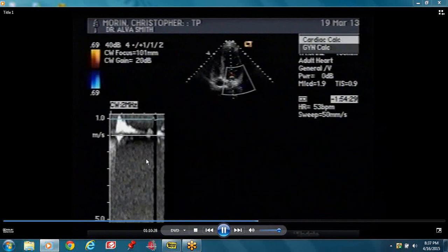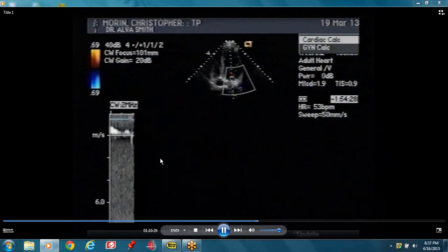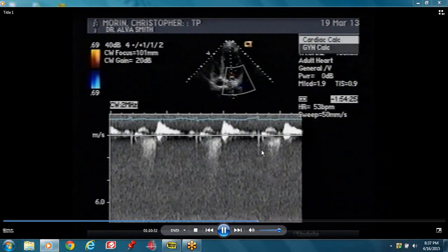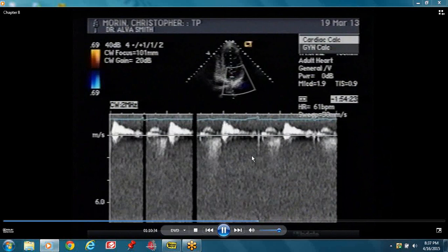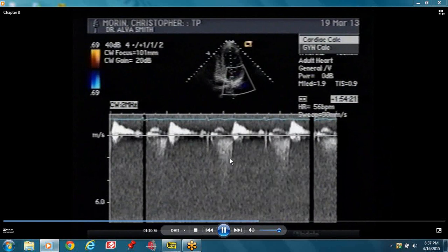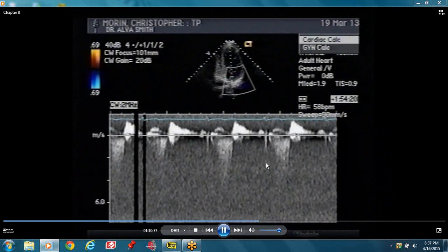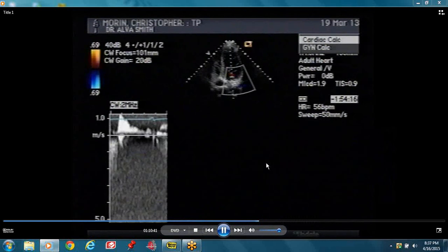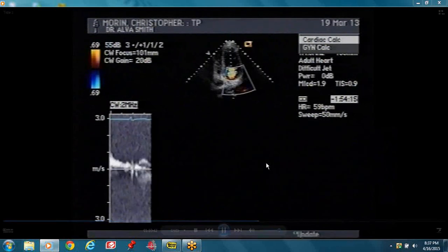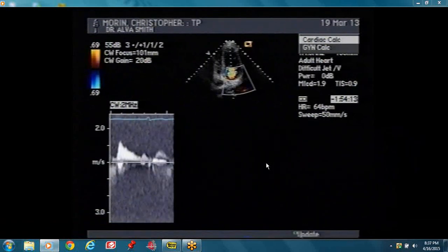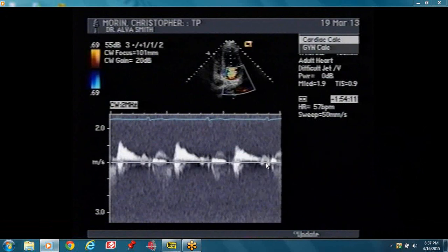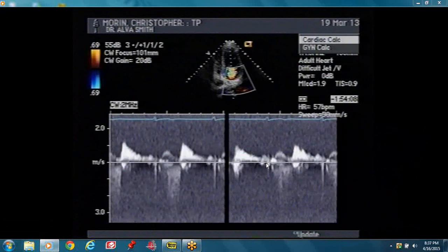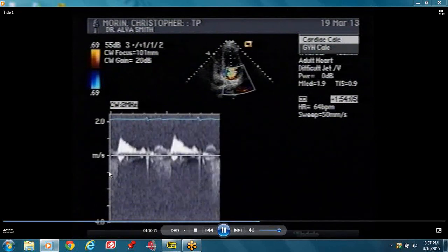This signal here is mitral regurg but it's insignificant. It's not a complete envelope. It's not dense. Even from the color flow, the color flow was not very prominent as well.